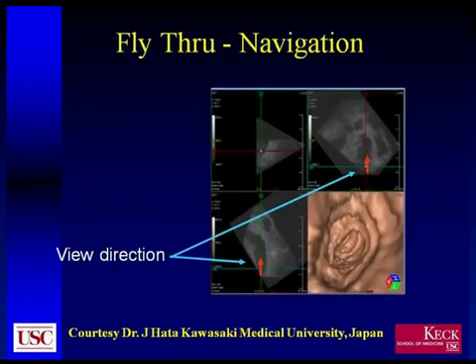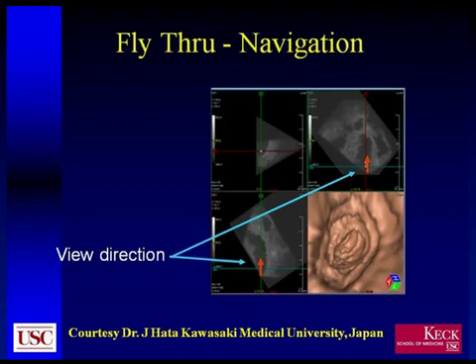There is also the possibility of doing actual fly-through navigation yourself, depending on what it is you're looking at and what you'd like to know. You can actually direct the arrow, or the line of sight, through the bowel, for example. In this directional navigation mode, if you are looking at a bifurcating vessel, you can actually choose which of the two vessels you'd like to go into and interrogate. Likewise, if you're looking at a polyp in the endometrium, you can actually come around the back of it and see it from behind.